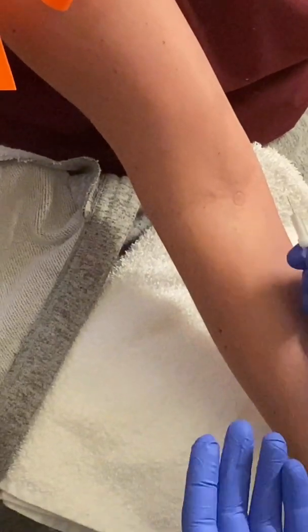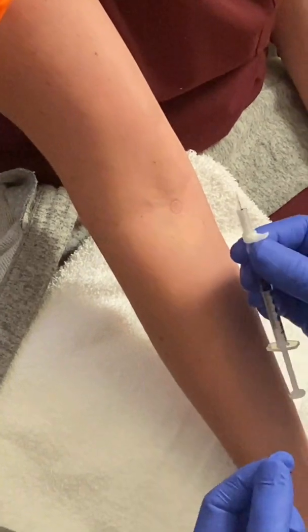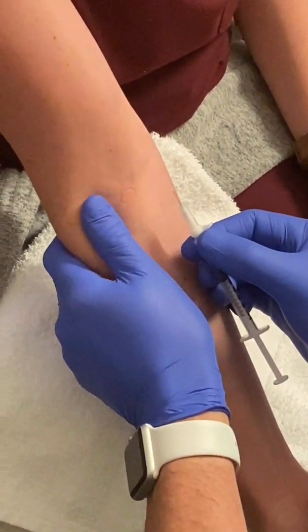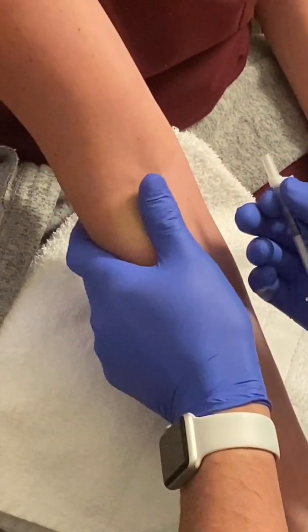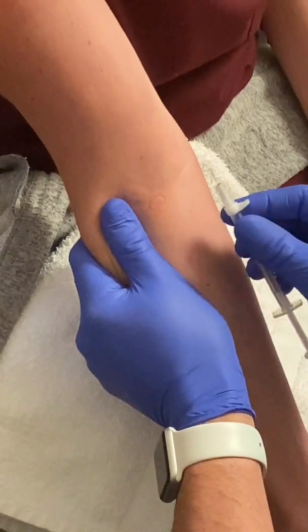With the lidocaine here, we don't want to inject in the vein. This is just under the skin, barely under the skin, like a PPD or TB test. But I will pull the skin off to the side. You can see the veins here, and I pull the skin right over to the side here, so I'm not going to inject it accidentally in the vein.